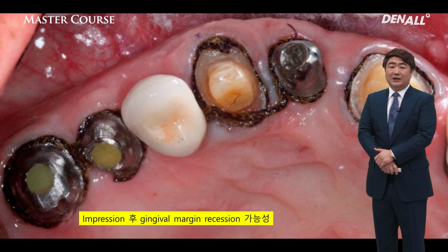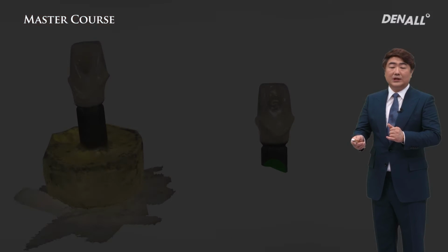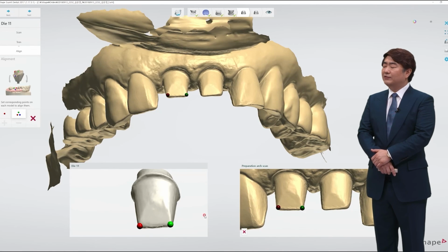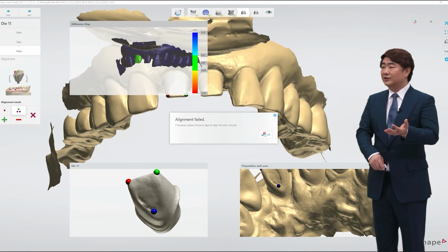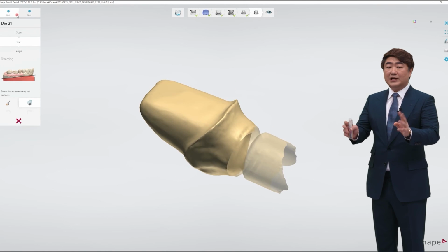So if possible, at the abutment level, rather than impression taking, I think a scan can deliver more favorable results. With the abutment level scan and the margin area, even if it's not really clear, if beforehand you had the abutment scan before it was delivered to the mouth, then the abutment level scan result can be superimposed like this or integrated like this. And a margin sharply exposed abutment level scan can be additionally created.